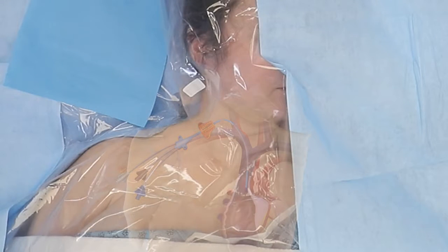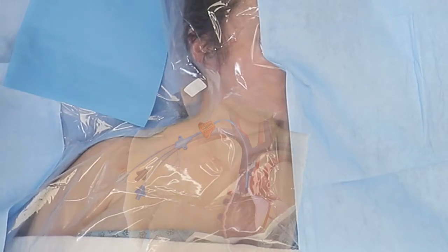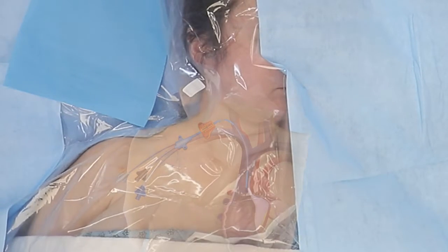The best approach for choosing an insertion site when using SecuraCath is a lower down placement of the central catheter, just above the clavicle, as per the illustration shown.